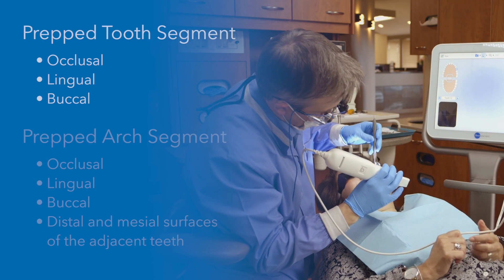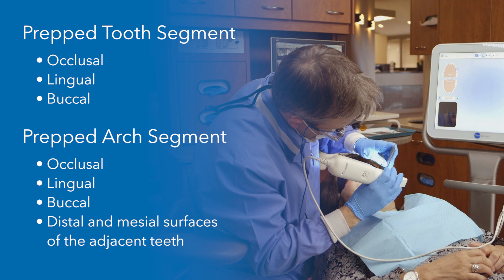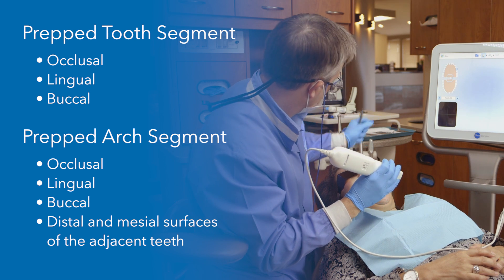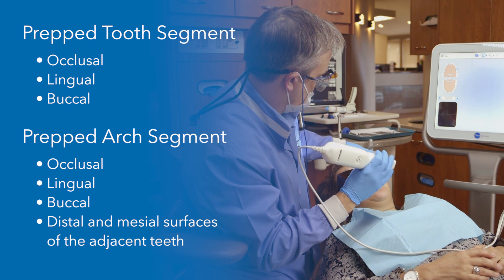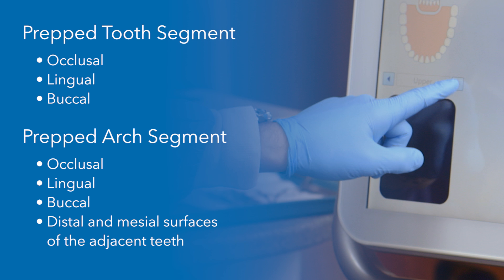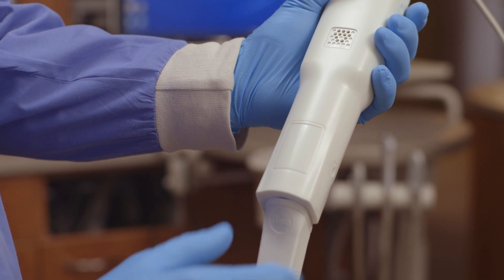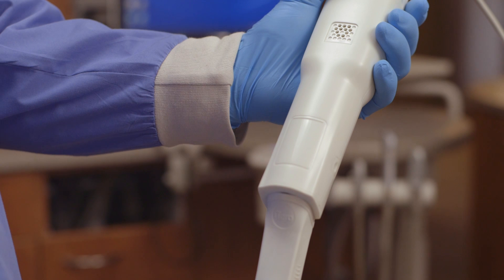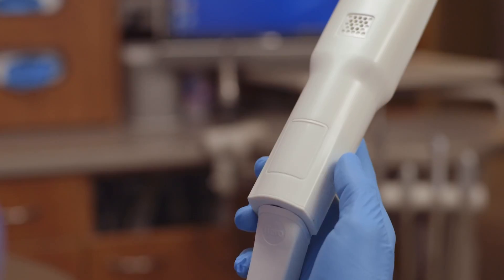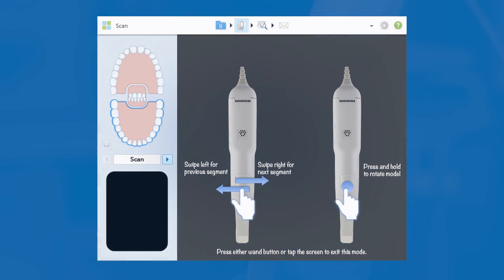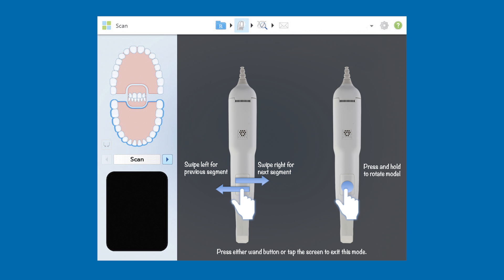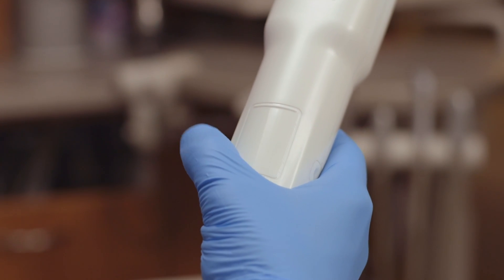Now that we've completed scanning the opposing arch segment, we are ready to scan the prep and the prepped arch. To move to the prep segment, I will either tap the arrow key on the segment indicator box or use the touchpad on the wand. Using these methods will ensure that I capture all the required scanning segments. To activate the touchpad, I will press and release both wand side buttons simultaneously, then use a steady firm swiping motion from left to right to move to the next segment. To go back to a previous segment, I will swipe from right to left.